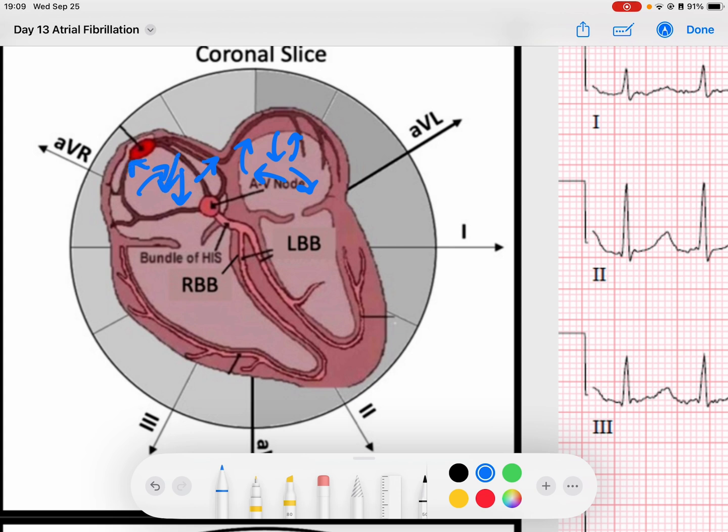We get a signal just sporadically going through the atria. As you can imagine, we don't get P waves. We get no P waves. What we end up getting is these atrial fibrillatory waves. So the atria is kind of just quivering. We get these fibrillatory pattern within the atria, and that fibrillatory pattern is going to be low amplitude because our atria is a small muscle.